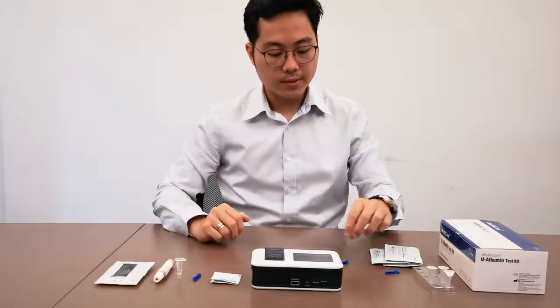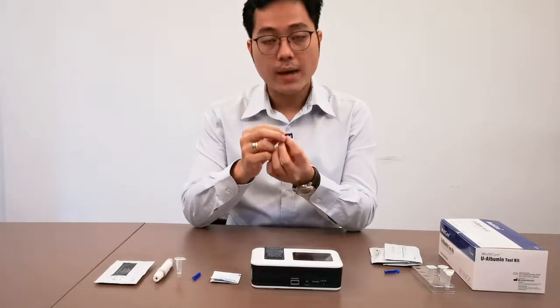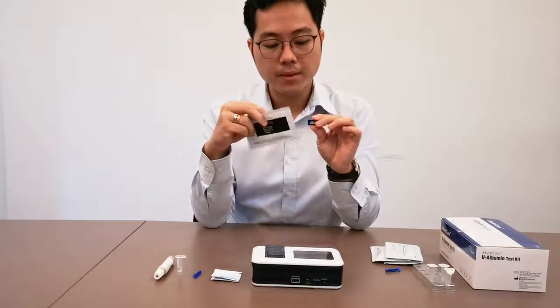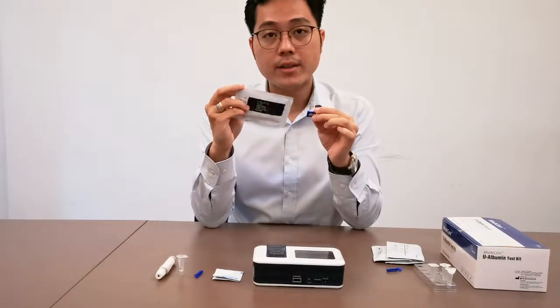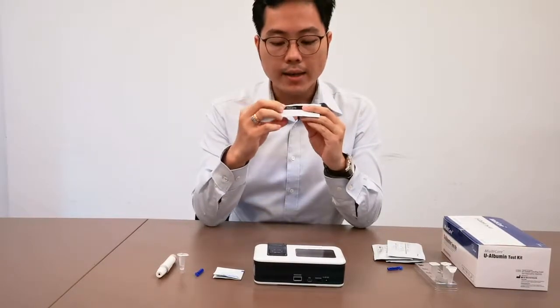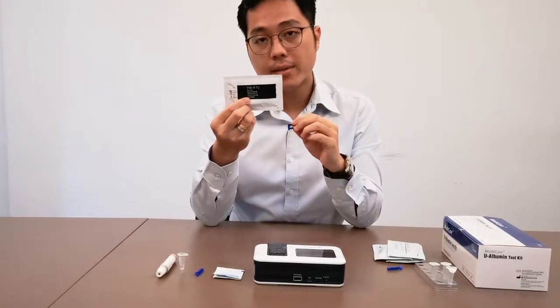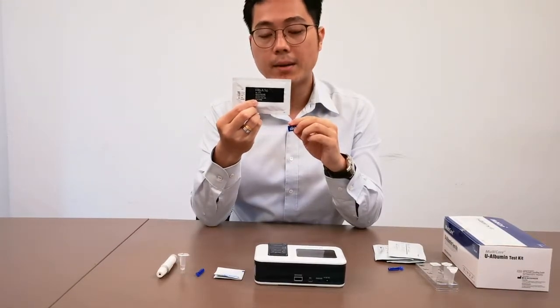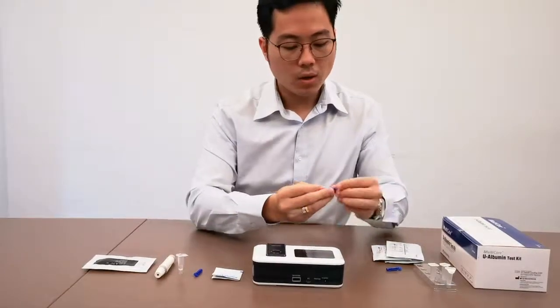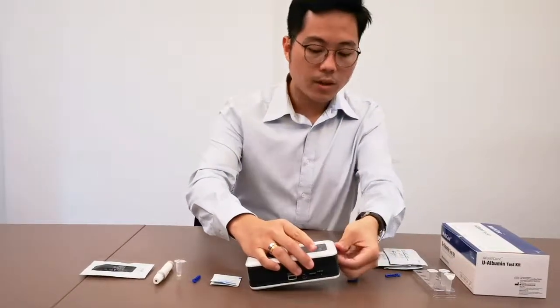Before we do the test, we have to make sure that we have this code chip. This code chip must be the same number as the back of the HbA1c test kit. As you can see here, it's 089, and behind the test kit there will be a number as well — 089. So if it matches, then you put the code chip into the code chip slot.